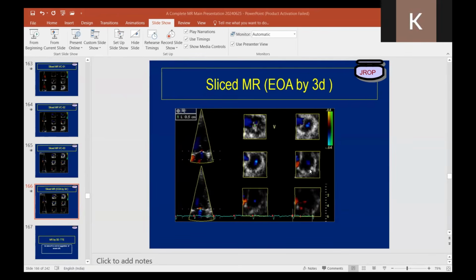Sir, as you set the Nyquist limit from 50, 60 to 20, what does that mean? I cannot understand. How do we assess whether it is to be drawn to the 20 or drawn to the 40? Keep your Nyquist limit between 50 to 60. Make it a simple formula.